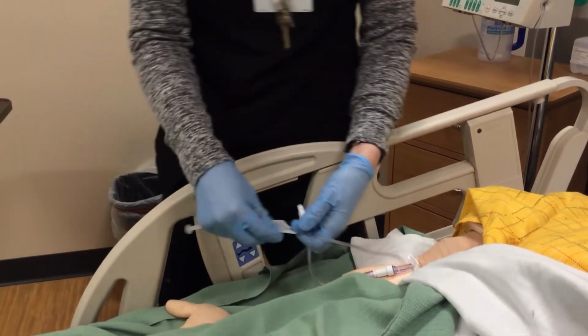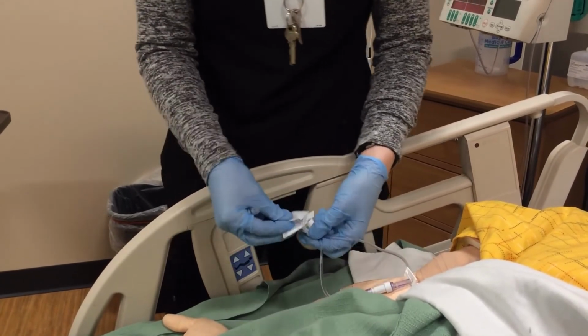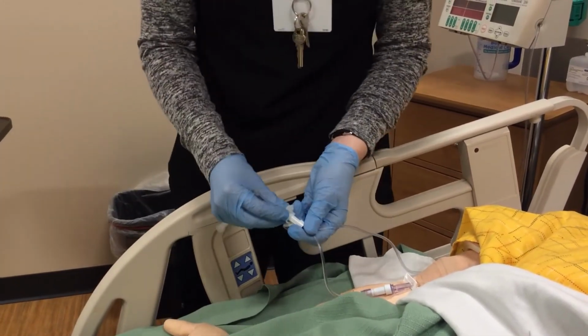Anytime that you leave that port, whether you touch it or not, really best practice is that you alcohol swab that port off again, okay?